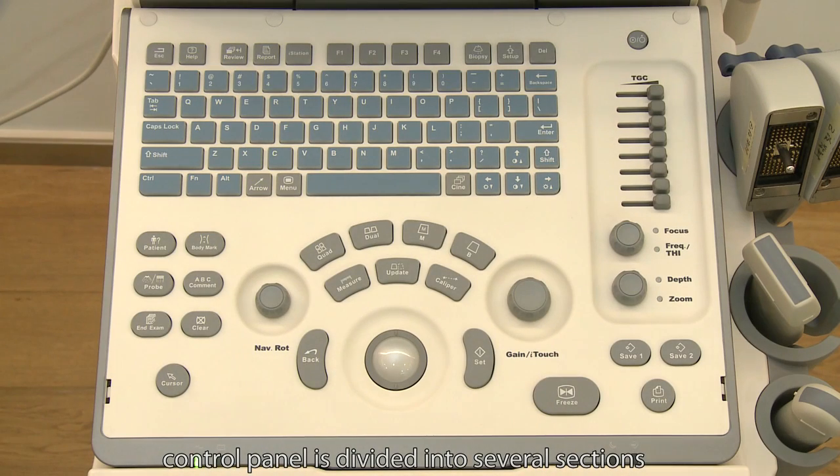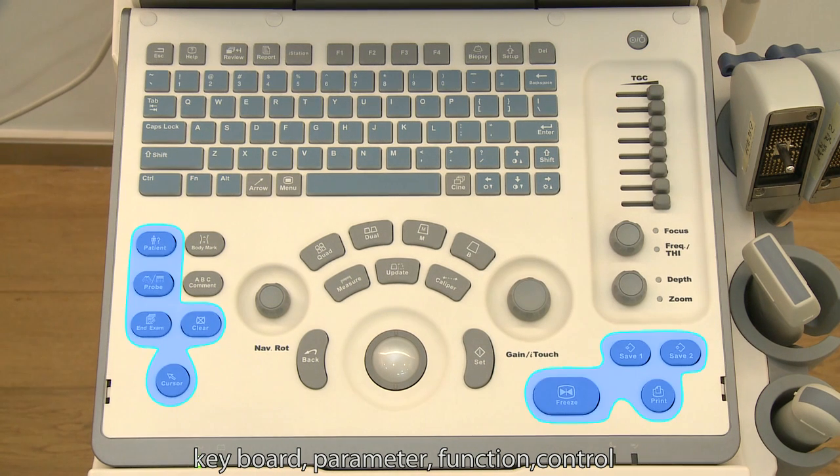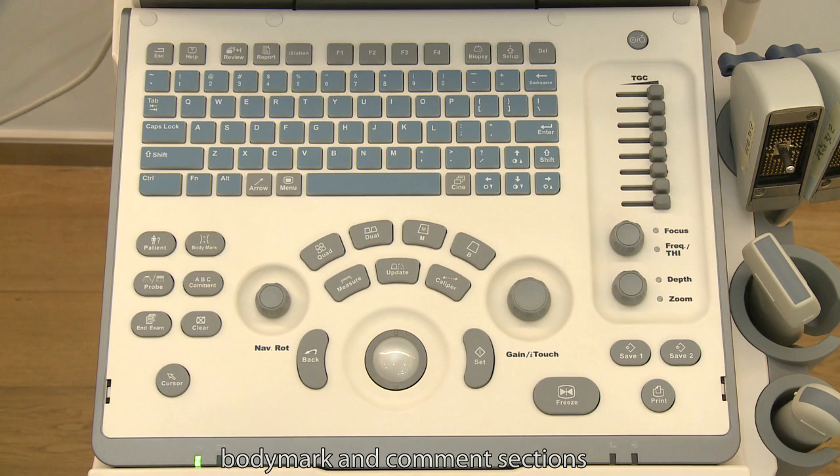The control panel is divided into several sections: keyboard, parameter, function control, body mark, and common sections.